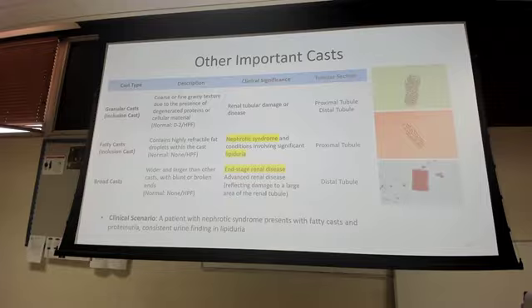So if you have a female who has back pain, dark yellow urine, and the renal tubular cells are greater than 3 per high power field, what are you all thinking? This time it's not a UTI. Okay, good. You're thinking some type of renal tubular damage.